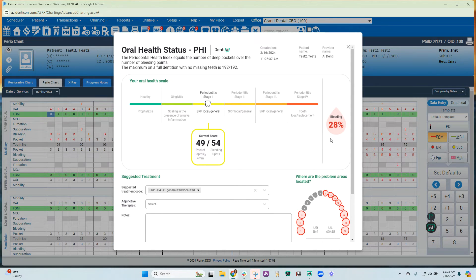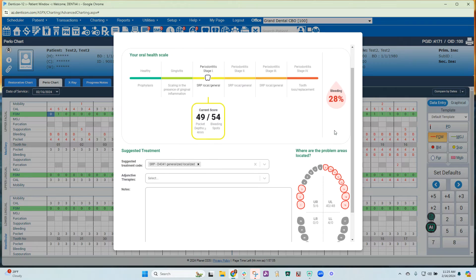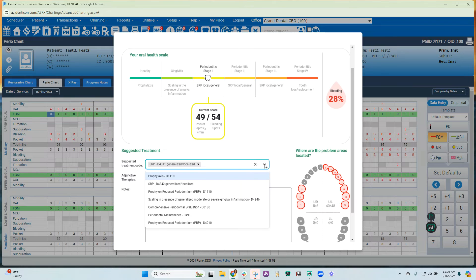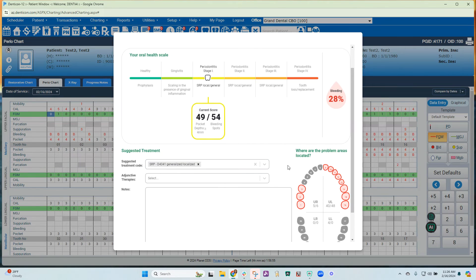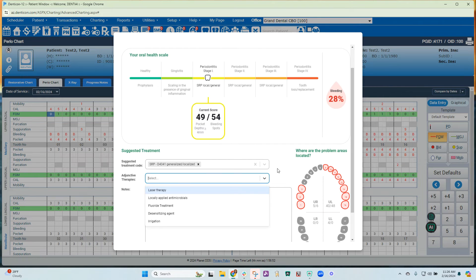It will also auto-generate the bleeding percentage here. Based on the stage above, it will put the patient into a suggested treatment code, but there's also a drop-down box that shows you other codes you could choose. You can also select adjunctive therapies.